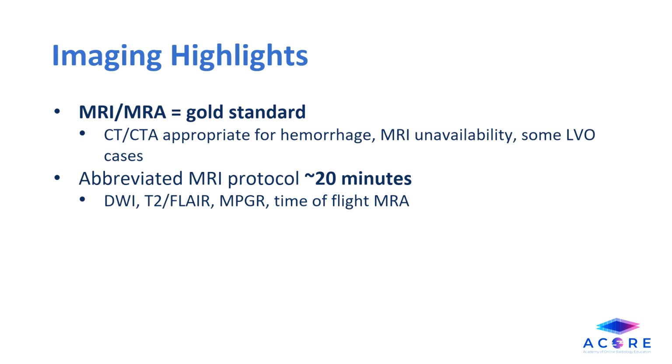The abbreviated protocol is emphasized so heavily in this article because it lasts only about 20 minutes and minimizes sedation requirements while maintaining diagnostic accuracy that's comparable to a full MRI. When you consider the patient population and time-sensitive nature of stroke pathologic processes, these benefits cannot be understated.